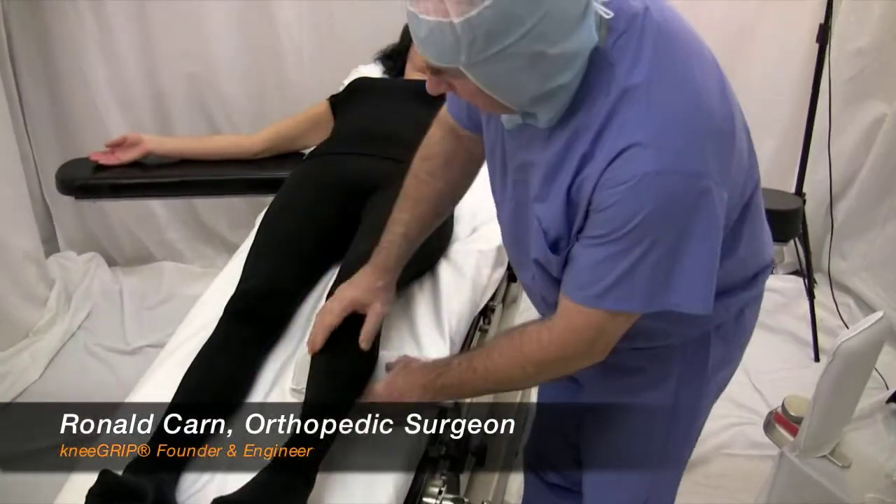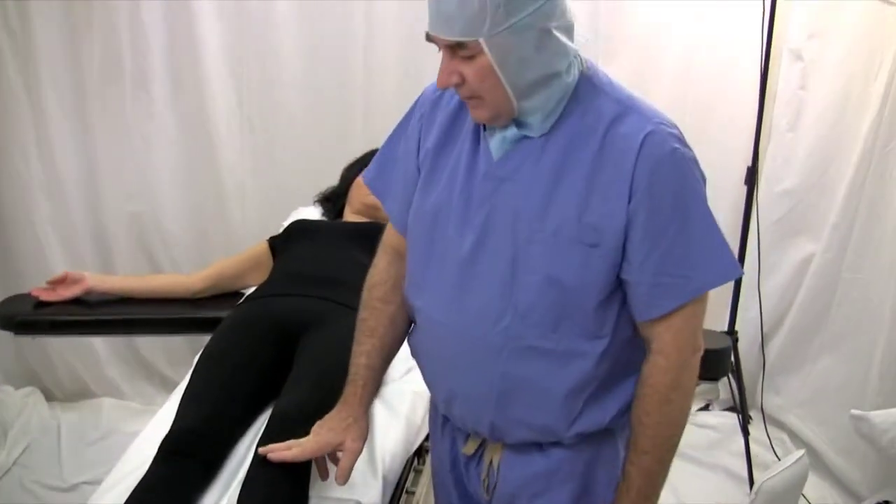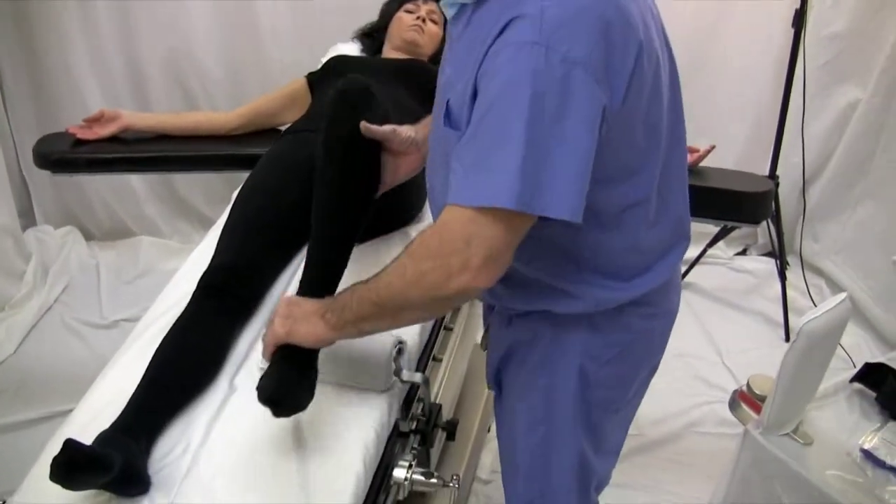The first thing I'm going to do is to place the footrest. The footrest is about two finger-breadths below the tibial tubercle so that the flexion desired at the time of surgery is correct.